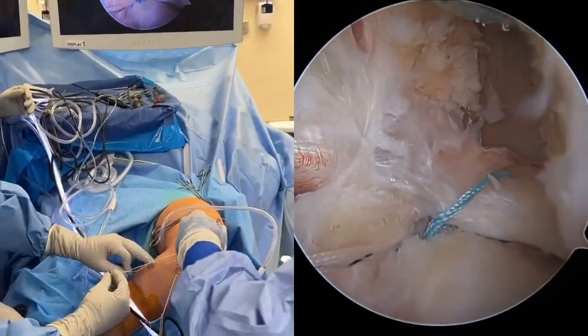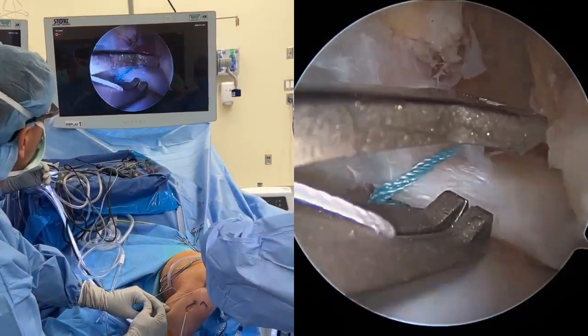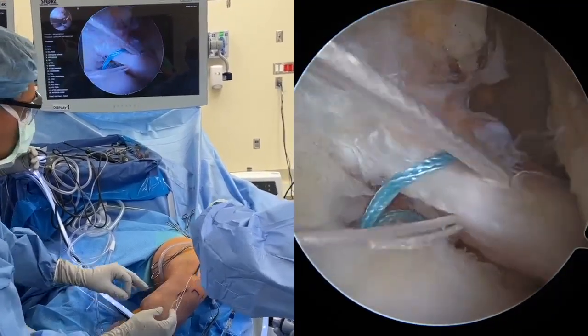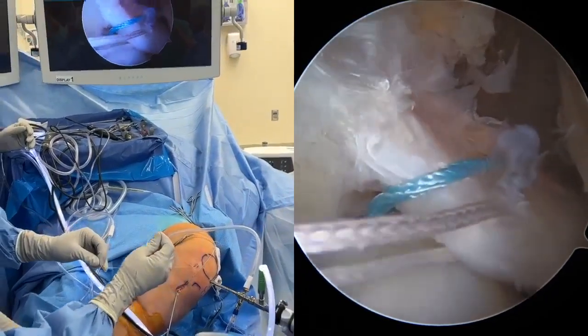These steps are then repeated. Working through the inferior medial portal, the solid white repair suture is loaded into the knee-scorpion suture passer, passed through the posterior meniscus root, and shuttled back outside the knee.